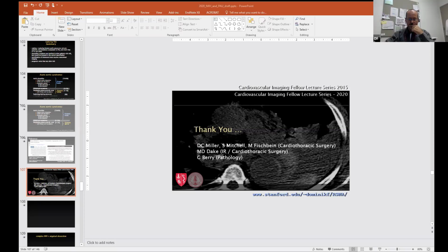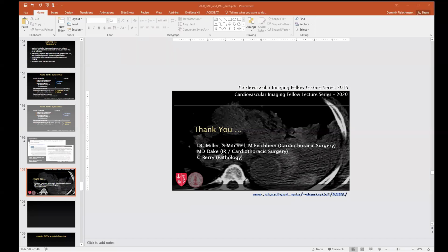My question was more in terms of all these patients who do get their dissection protocols, assuming that they do have some degree of symptomatology, and given how common ulcerative plaques are in this subset of patients, how do we manage the follow-up?